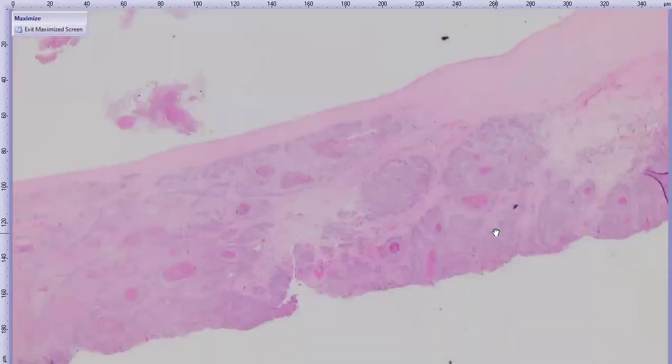All right, let's take a closer look. I think this will make it backward from what we just had. Possibly. Yes, it will. Okay, hang on. I can make it the same orientation as we had before. There we go.